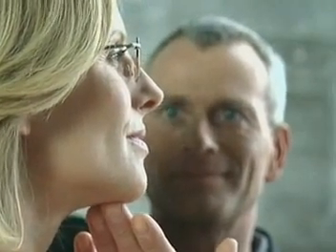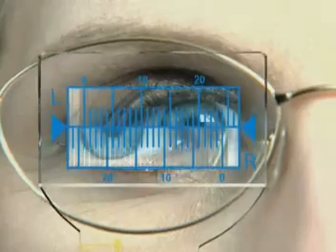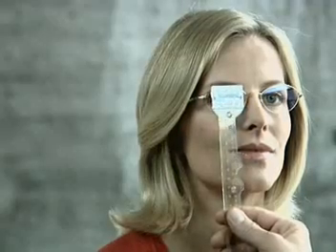Equally important for the optimization of Impression ILT is the corneal vertex distance of the prescription frame, which can be measured at the side if the frames have only a slight bow. A simple method of measuring this is provided by the newly developed Rodenstock CVD ruler. First, put the frame plane in a perpendicular position and place the prism ruler flat on the frame. Now, align the blue horizontal line so that it coincides with the center of the pupil. The eye should be looking horizontally straight ahead.